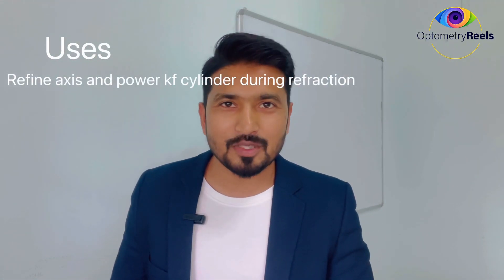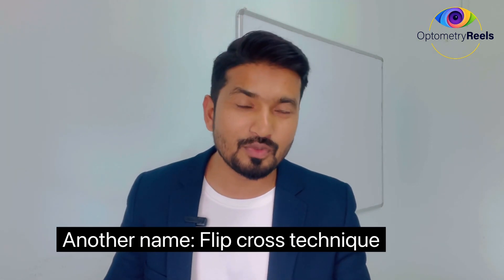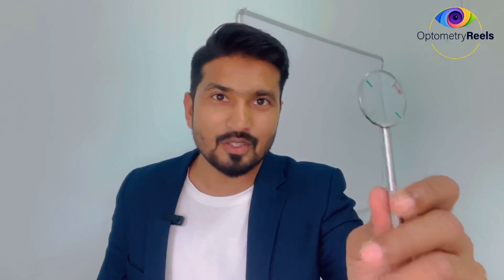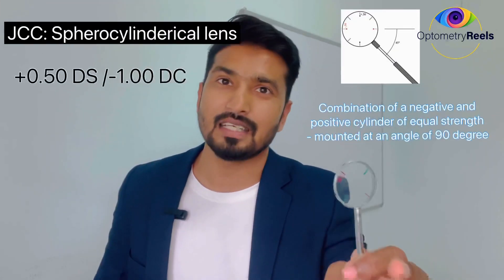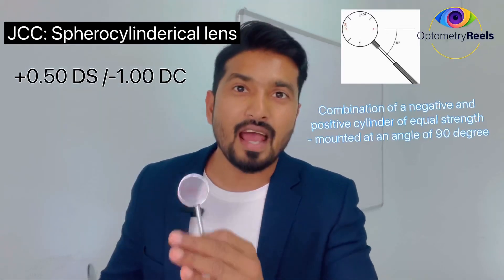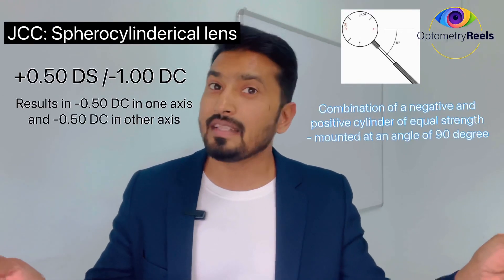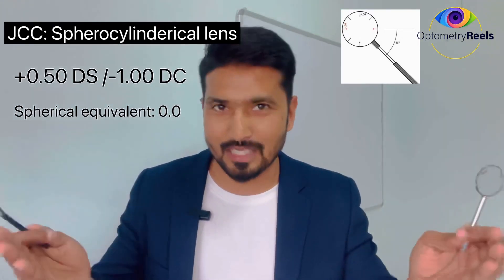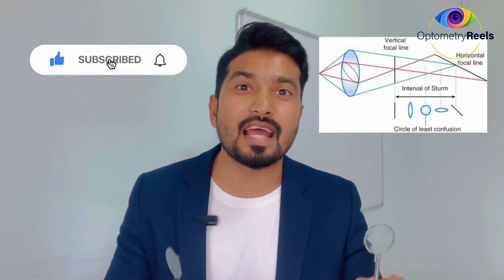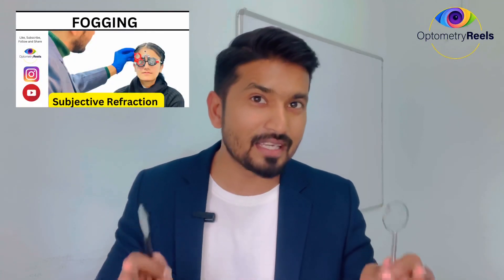This technique of refining the axis and the power of the cylinder is also known as the flip cross technique. JCC can be 0.25, 0.5, or even higher than that. The cross cylinder in my hand is a 0.5 diopter, meaning it is a sphero-cylindrical component having plus 0.5 as a sphere and minus 1 as a cylinder — cylinders are double and opposite in sign. If you do the spherical equivalent, it will be 0. This technique is performed when the circle of least confusion is at the retina, which can be achieved by doing the fogging technique in refraction.